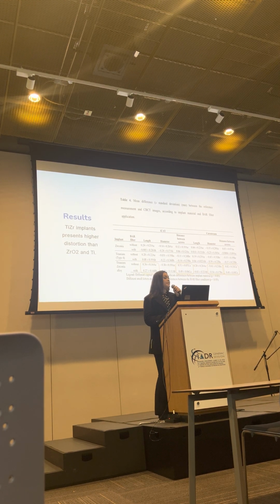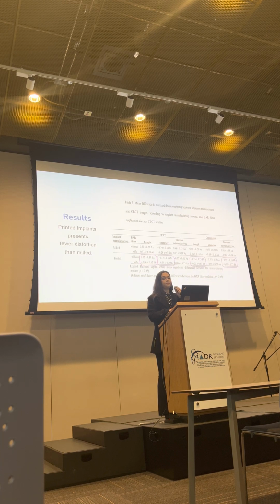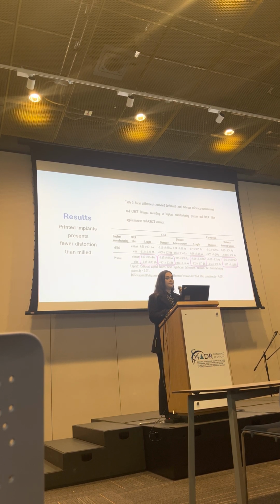In table 4, we can see that the titanium zirconium implants present higher distortion than titanium and zirconium. And in table 5, we can see that the printed implants present less distortion than milled. And this can be explained because the milling process produces denser implants and higher tomographic artifacts.